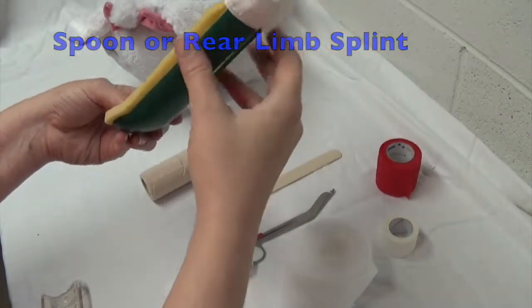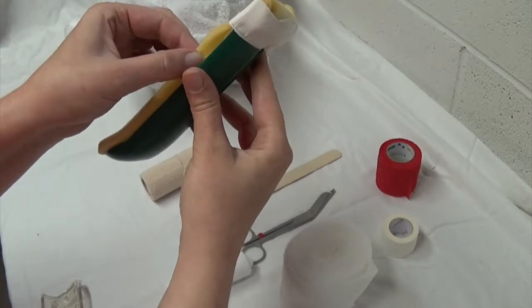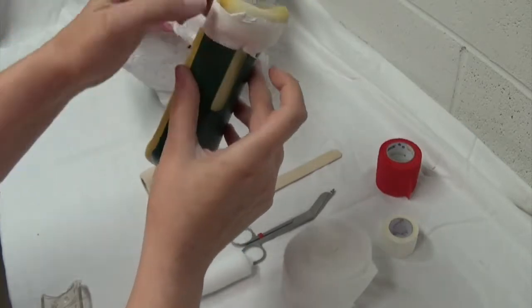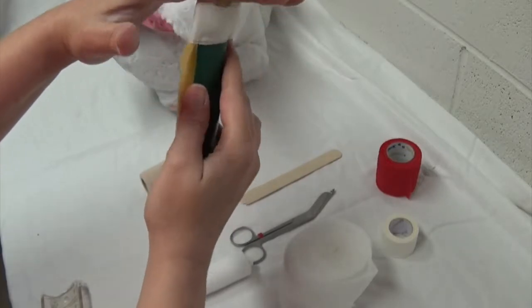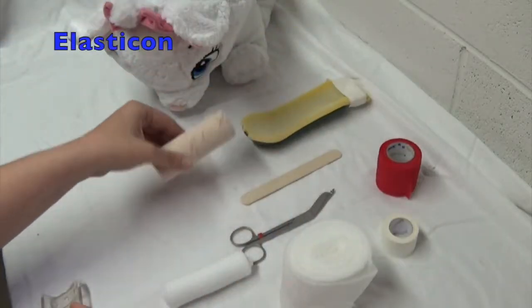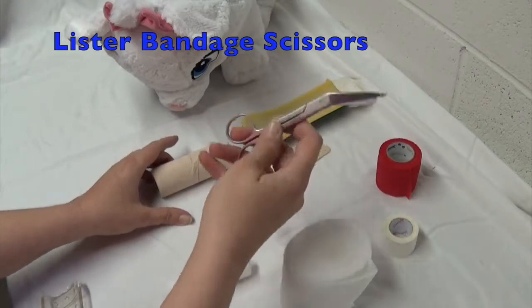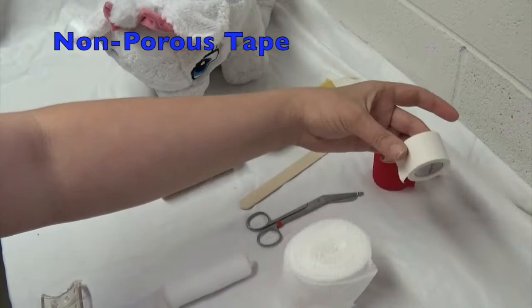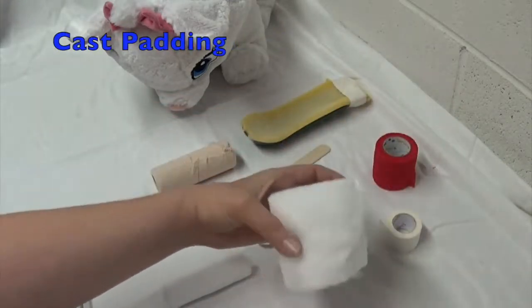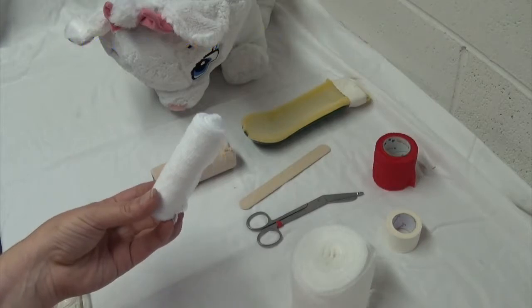Cut to size for the patient and padded at the end. You can use some foam, just bend it down and tape it down — that should add quite a bit of cushion so we don't get any chafing. Other materials include Elasticon, tongue depressor, bandage scissors, vet wrap, non-porous white tape, cast padding, and stretch gauze or cling.